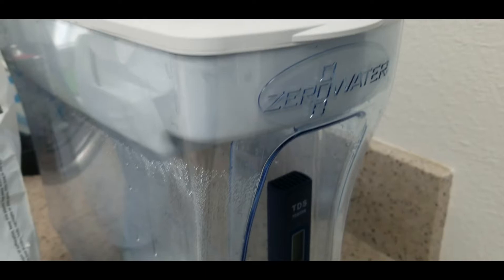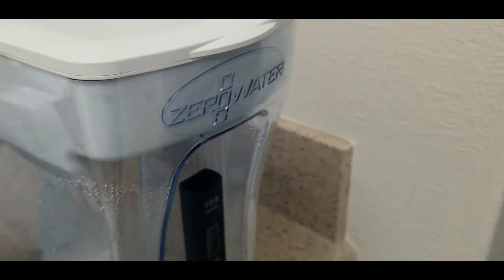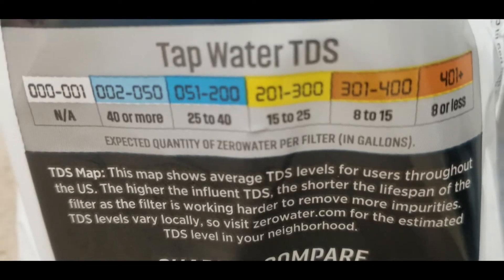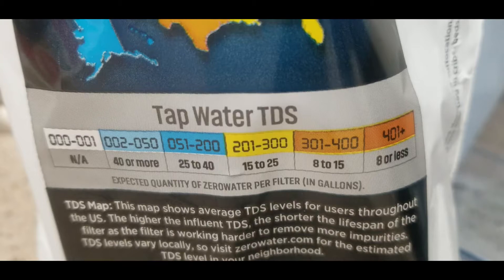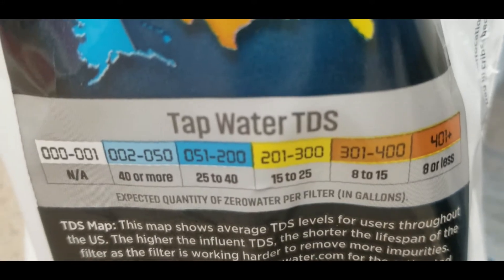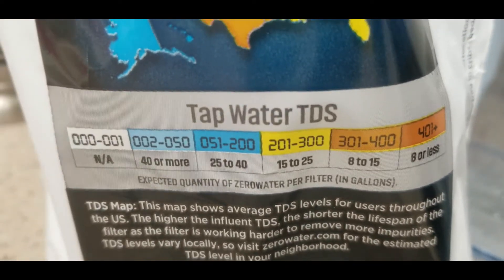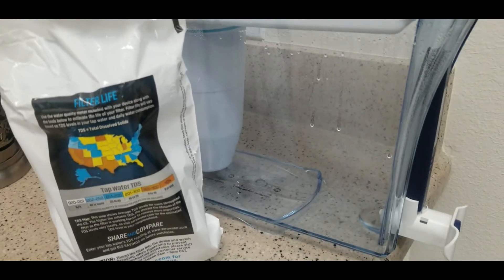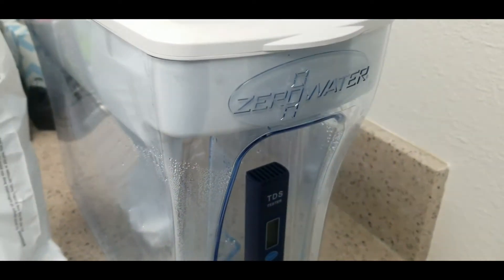The zero water filter is easy to use, but the downside is you have to buy filters, and if you have really hard water they won't last very long. Looking at the TDS map, it shows tap water total dissolved solids levels by area. We're in Utah, rated at 200–300 on the map, but in my city we're actually over 400, so we're only getting about five gallons per filter.